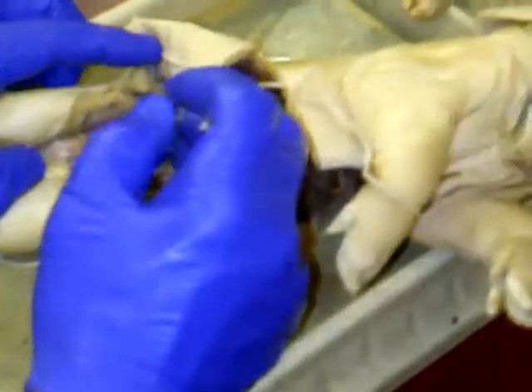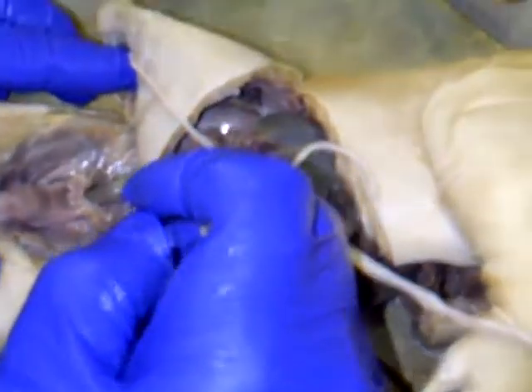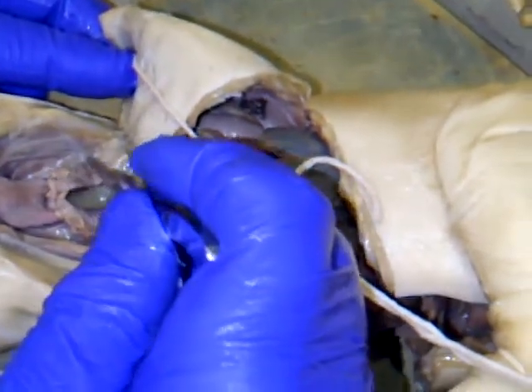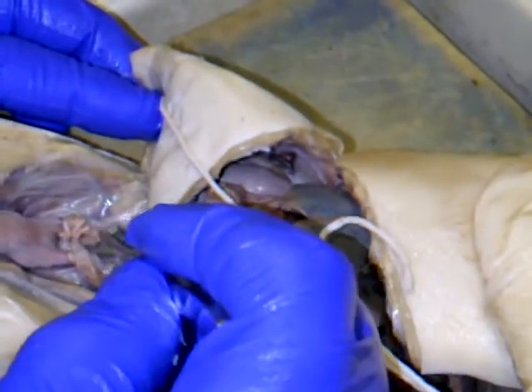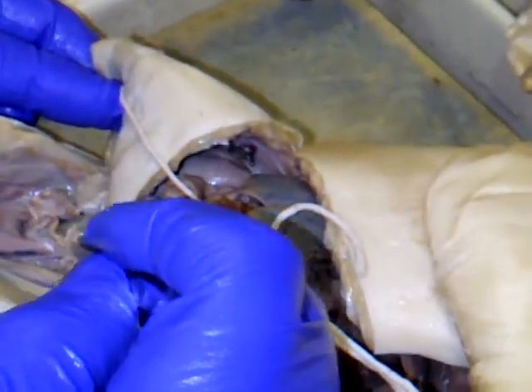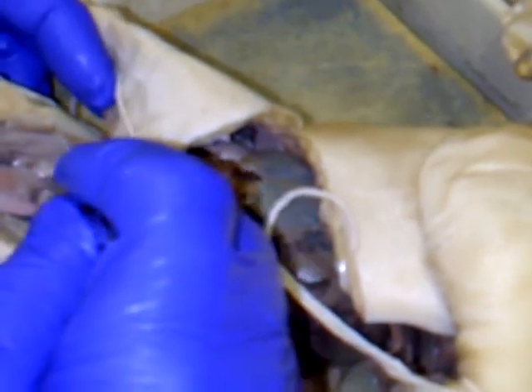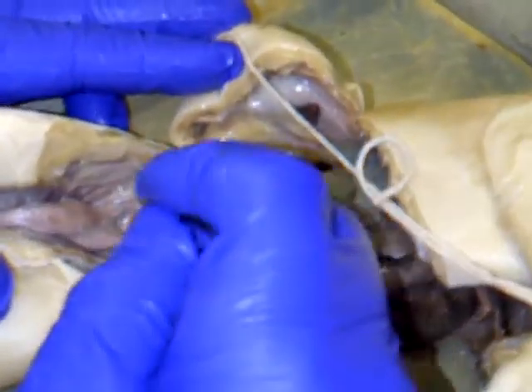But before we even cut, you can see very clearly, there's ovaries. That's one. That's the other ovary. The ovaries remain in the abdominal cavity. And you can see closest to the ovary is this very, very thin squiggly tube here. Right? That's the fallopian tube. And the thicker tube, which is anchored to the wall by this broad ligament, right? This broad piece of connective tissue that anchors it to the dorsal wall of the abdominal cavity. Those are the uterine horns.